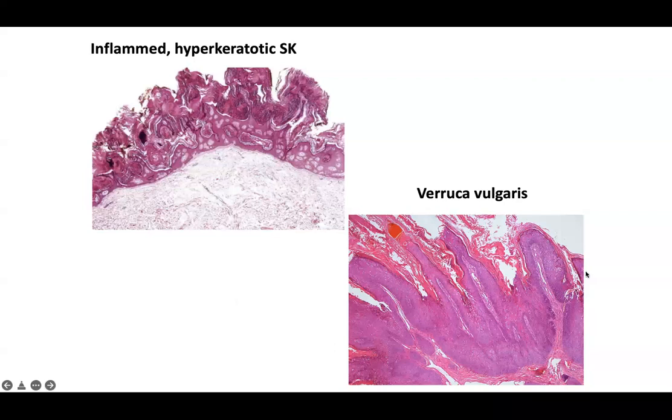Verruca vulgaris can present many different ways as well, but some of the key features are papillomatosis architecture, this elongation of the epidermis, as well as a parallel elongation of the rete ridge with dilated vessels. The dermal papilla with dilated vessels, and then the corresponding rete ridges. And you've got clear cell changes. You've got punctate basophilic granules. You have towers of parakeratosis with intracorneal hemorrhage. And if you go on high power, you don't find severely atypical mitotic figures or highly elevated mitotic figures.